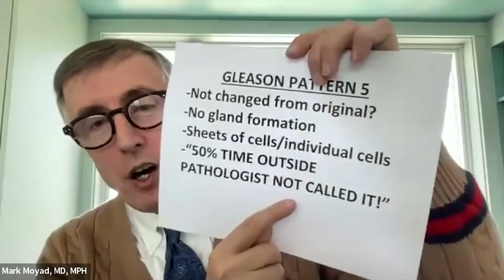What about Gleason pattern 5? You said 50%. Was this a different lecture? 50% of the time, outside pathologists did not call it, first of all, and no gland formation. We know what a 5 is based on your setup, but can you repeat that again? That people don't like a Gleason pattern 5. People don't like to call it a 5. Why would that be? Because you're making too strong a statement and having too much confidence in your reading.